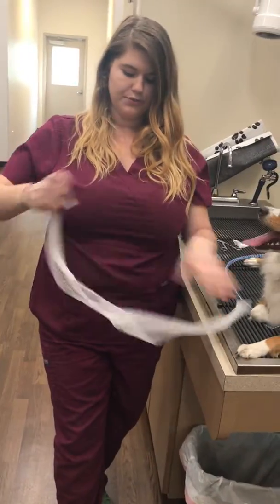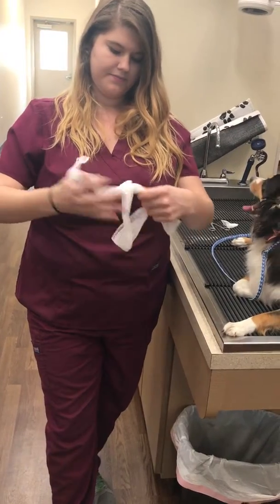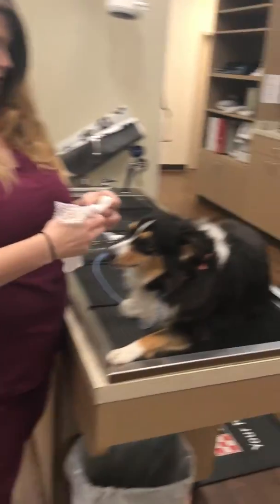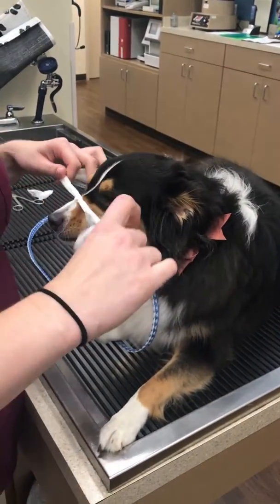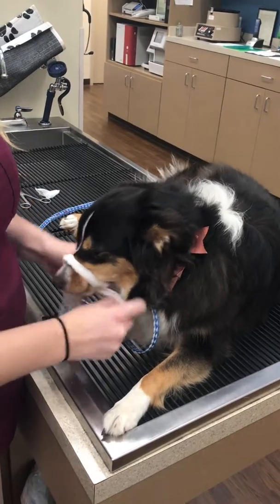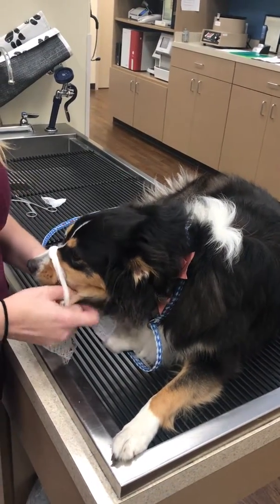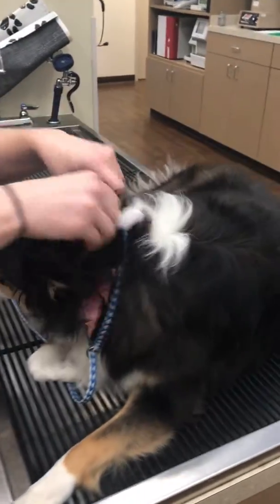We're going to take the gauze and double it up and make a small loop with the gauze. Then we're going to put it around the patient's muzzle, tightening up one underneath of the muzzle here. And we're going to tie it behind the ears, underneath the mandible.